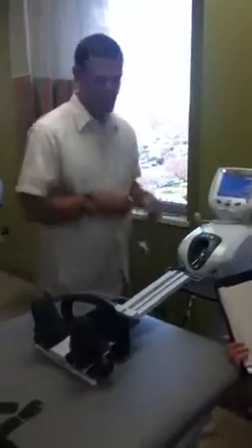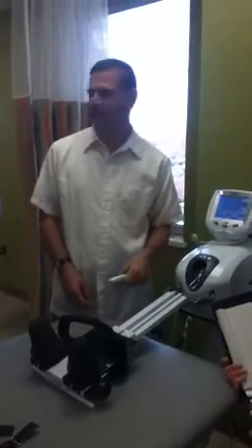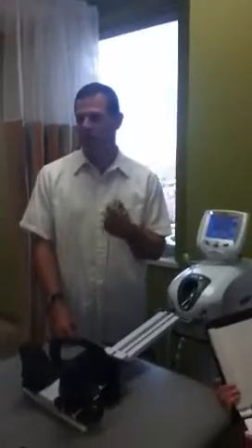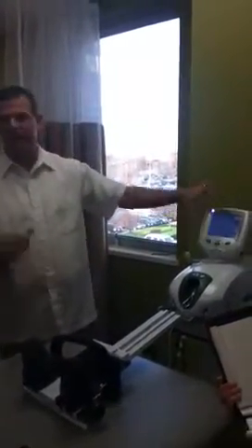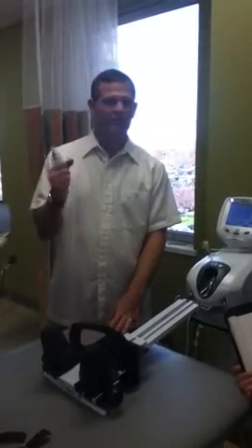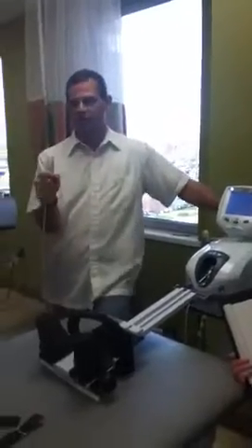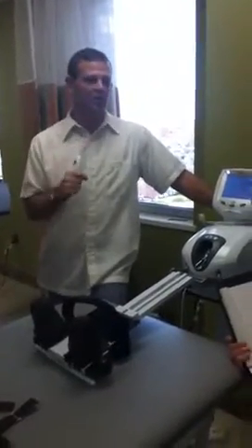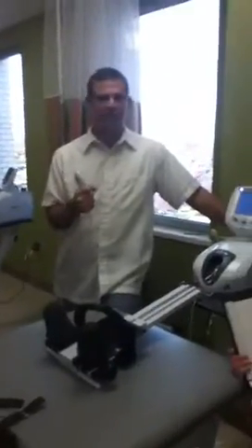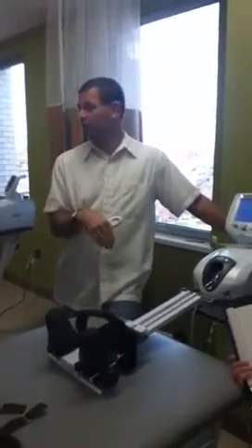I will never have a patient in my machine unless they have the kill switch — the stop button. Some people didn't like the word 'kill.' When the patient pushes it, it stops everything and starts beeping, and it won't stop beeping until I touch it. It's going to stop pulling and release the person. The second you start doing anything the patient could construe as potential traction, give them the stop button so they feel more in control, because it is disconcerting to have a machine that could pull a whole bunch of weight against something that hurts.